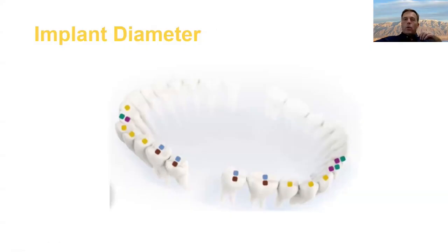So let's talk a little bit more about implant diameter. We talked about why we might want to undersize the implants a little bit in order to make sure we have enough bone and blood perfusion and stuff like that. So let's talk about why we want to have larger implants.